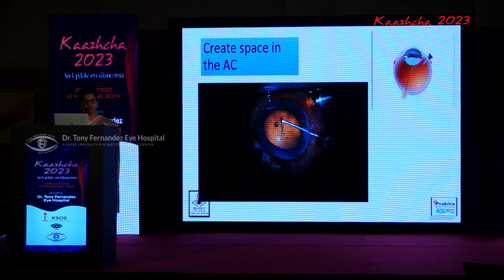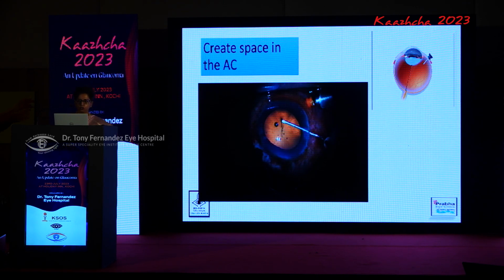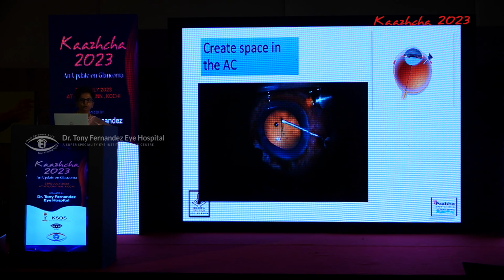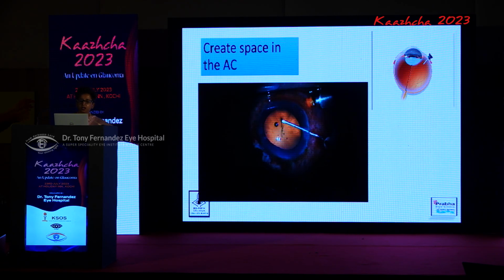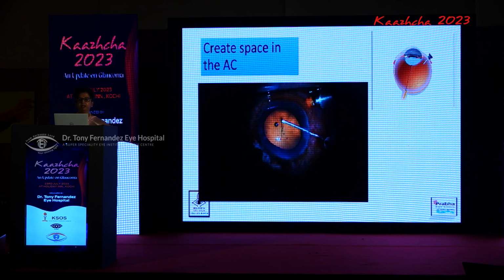So do not hesitate. I earlier used to call my VR colleagues to put this port, but now I do it myself. You can suture it at the end of the surgery with MIVS instruments being available. It is not such a big deal. So if there is less space, create space.